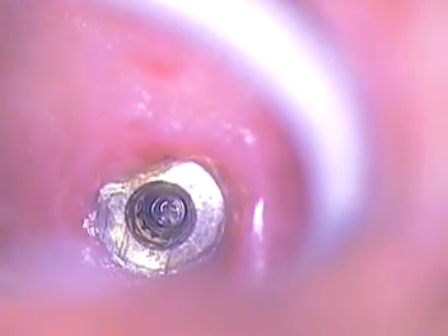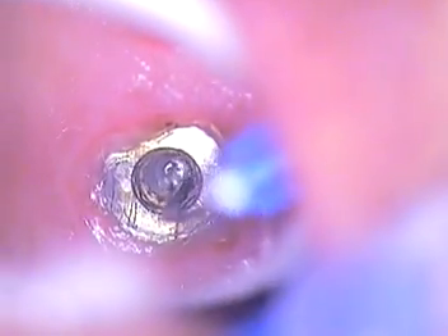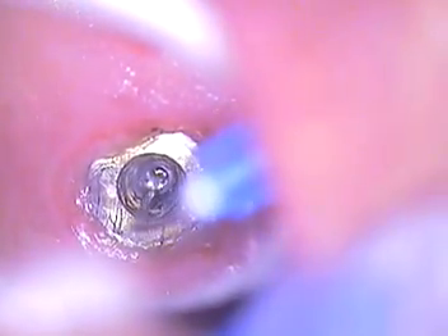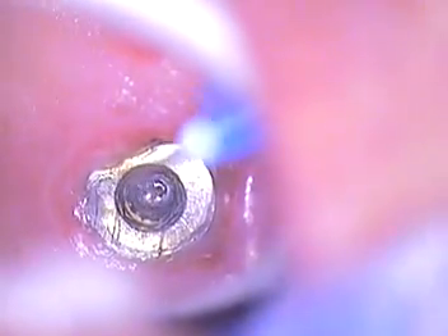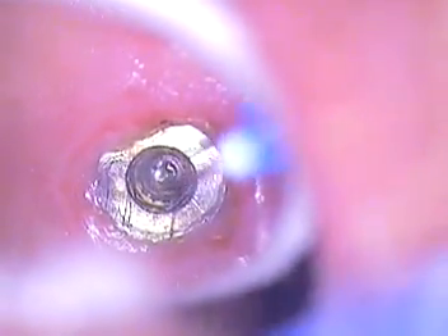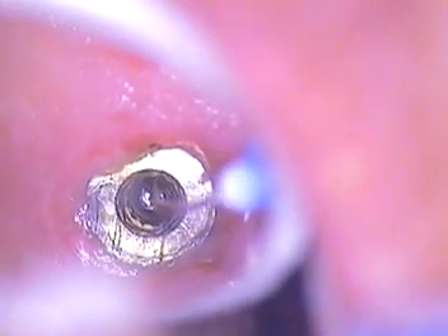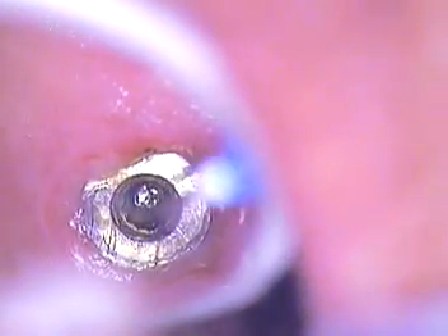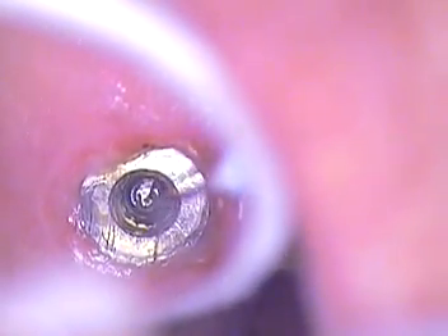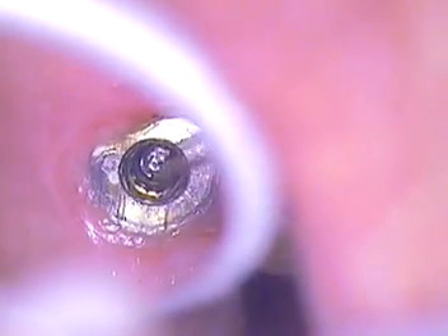Let's see if we can back out this one. Now it looks like we're going in a clockwise rotation, but it's actually through my mirror, so that's counterclockwise. We'll just move it along, put a little bit more solution underneath it, and just coax it. I really like to use a solvent like Tartar and Stain versus any type of petroleum — I would definitely not use petroleum with these cases.